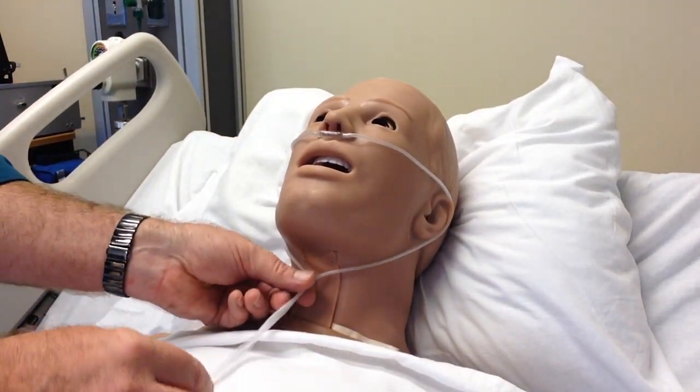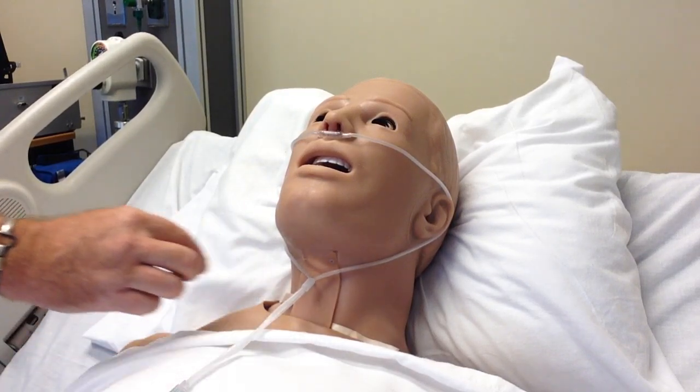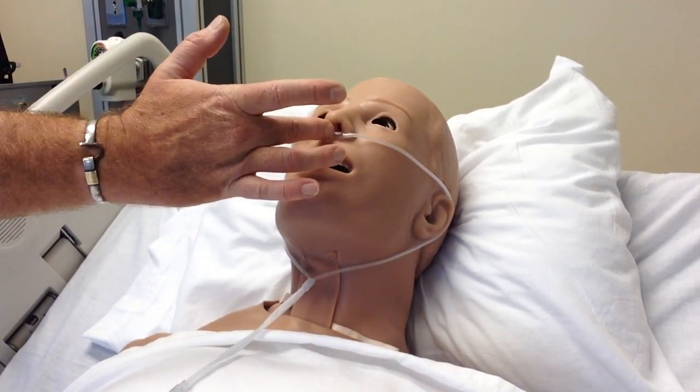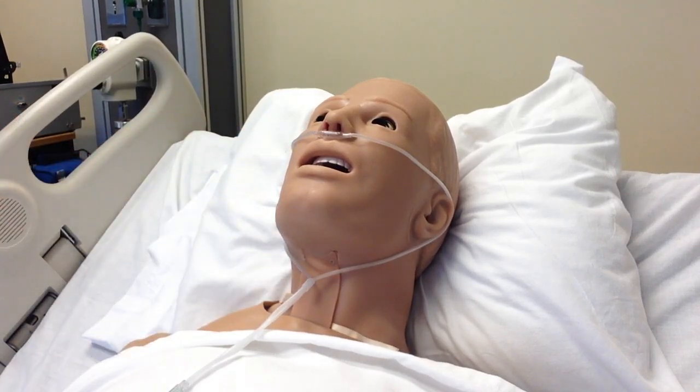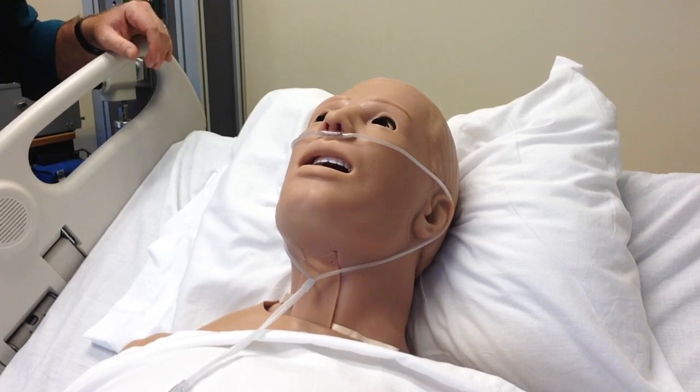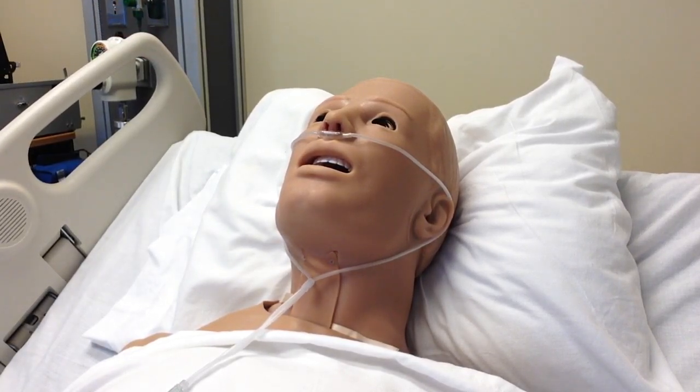And then pull the little lariat up. You do not wish to pull very tight because you can cause pressure ulcers here on the cheeks, on the nasal septum, or on tops of the ears. Anytime the patient has a facial ulceration, that is an automatic stage 3 ulceration, and it gets reported to the state. Okay. This nasal cannula will be running up to 6 liters per minute.